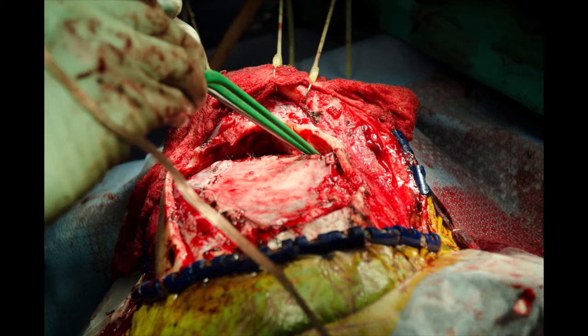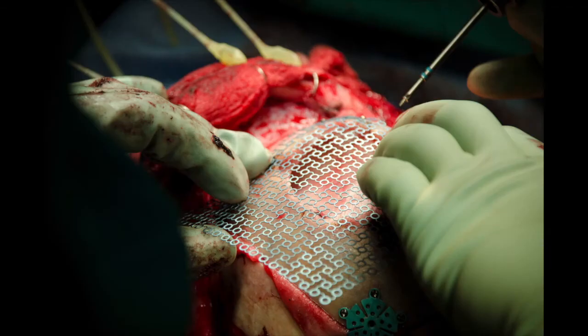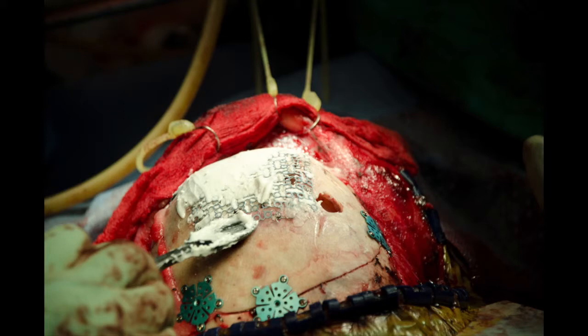Any discrete bleeding on the dural surface is handled with bipolar cautery. Likewise, epidural bleeding is stopped with a combination of Floseal, Gelfoam, and bone wax. A central tenting stitch is placed and a dural substitute is laid over the dural surface. The bone flap may be reattached in numerous ways. Our preference is to use metallic implants with cap plates over the slots and two long plates laterally to attain solid 4-point fixation. The wound is generously irrigated to remove debris and devitalized tissue.